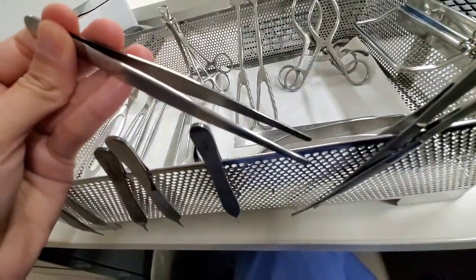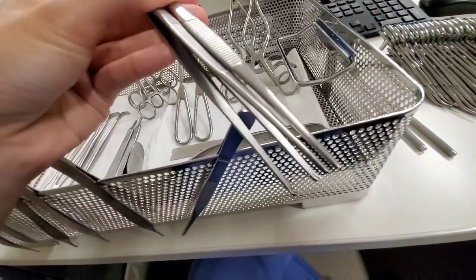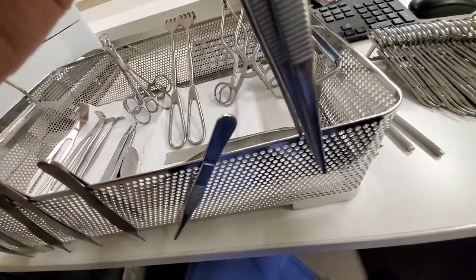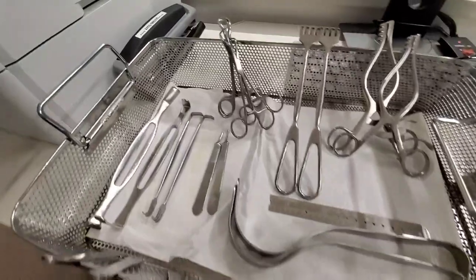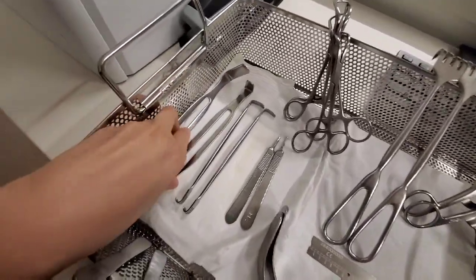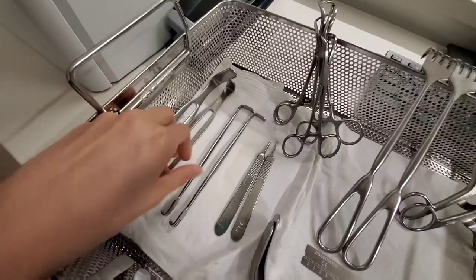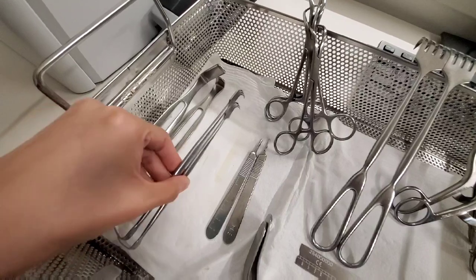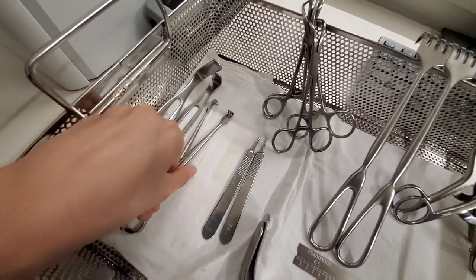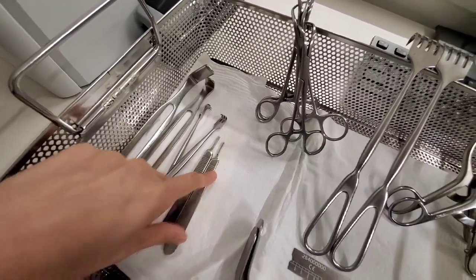This is smooth forceps, and this is forceps with teeth. Let's move on — these are Army Navy, these are sharp Senn retractors, and these are your knife handles; a 10 and a 15 blade can go in there.